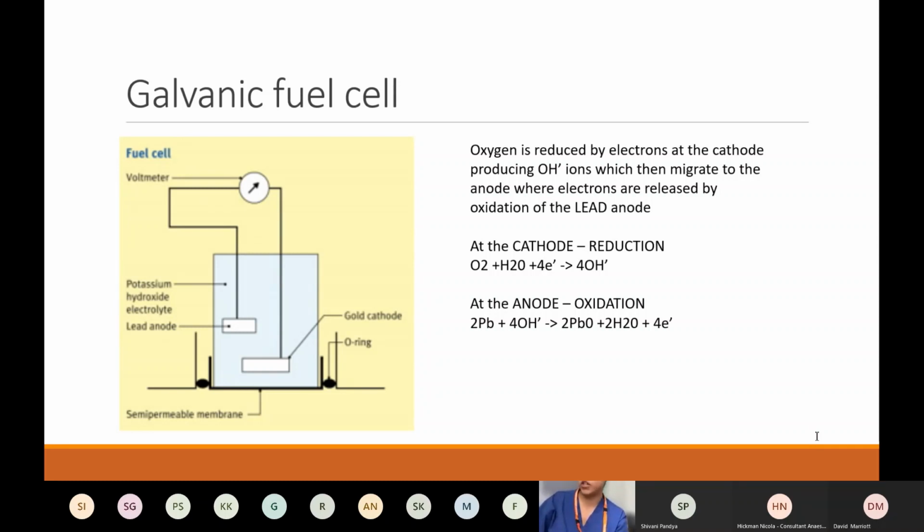So it's a voltage that's measured, and again the magnitude of the voltage produced is proportional to the concentration of oxygen. Again, there are things that it's affected by, so temperature has to be kept at 37 degrees. It does experience drift, and has a limited lifespan, and this is something that needs special nitrogen packaging.